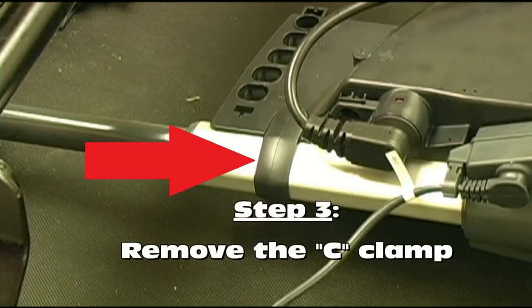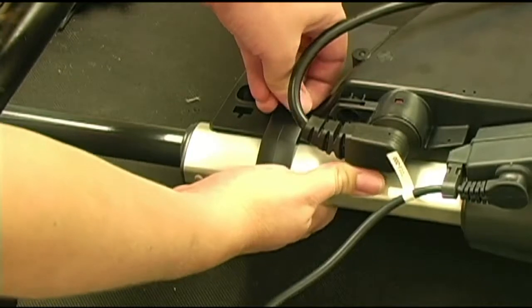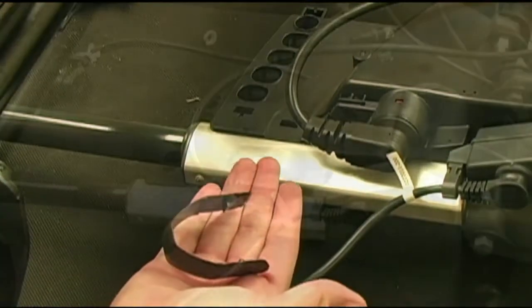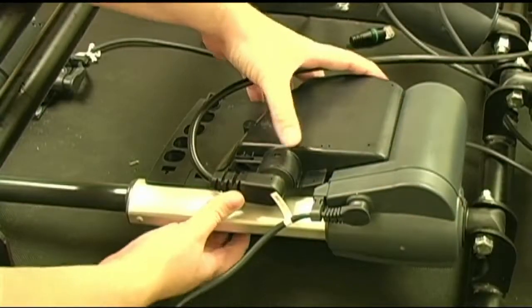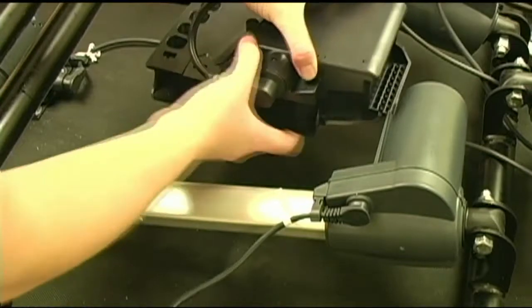Now that all the plugs have been removed from the control box, you need to remove the C-clamp that holds the control box in place and connects it to the head motor. The C-clamp snaps into the top and bottom of the control box. To remove the C-clamp, simply use your hand to unsnap the clamp from the control box as seen here. With the C-clamp removed, you should now be able to slide the control box off of the head motor.